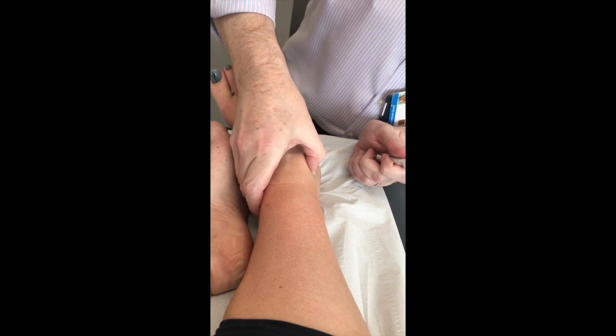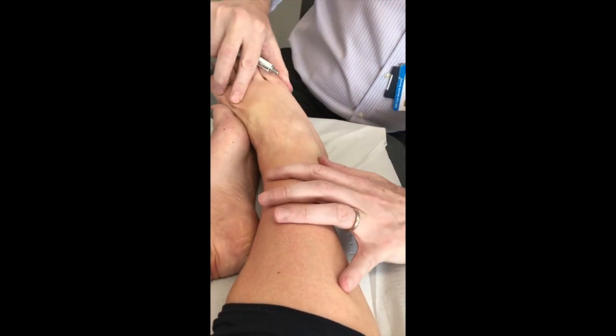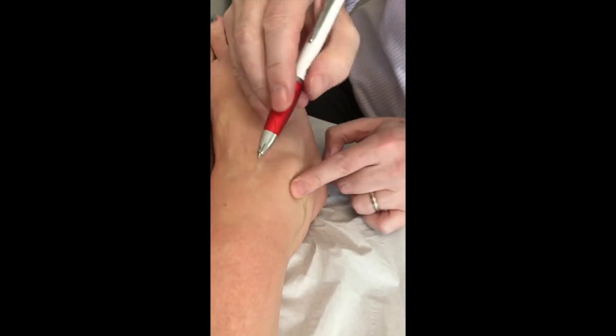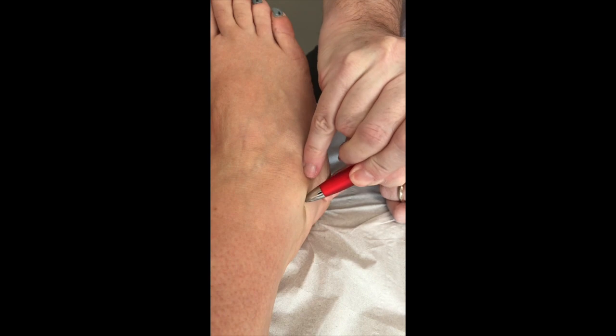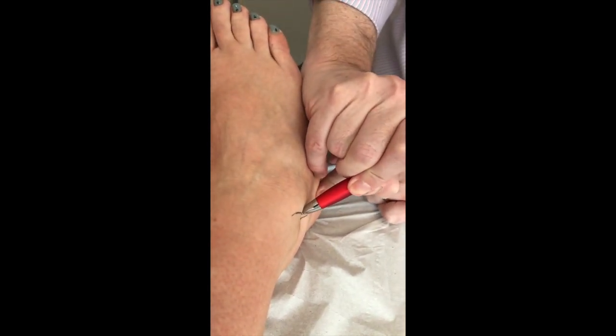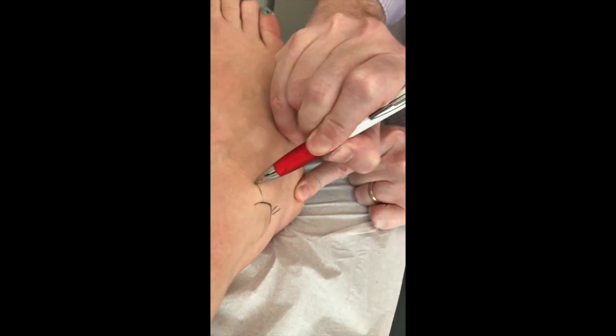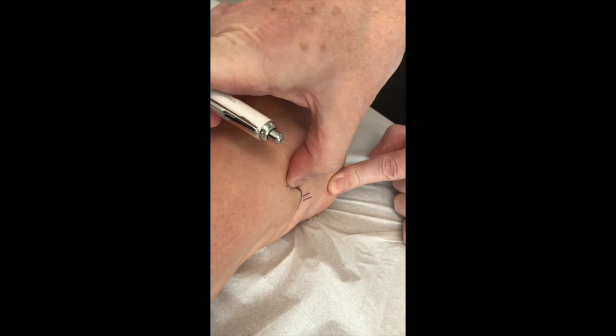So, two injections. It's your ankle that's sore a little bit, isn't it? So if I just mark up — Rebecca, if you can get that video. So this is Rebecca, not her real name — she's taking her own video. How brave is that? So I've marked up the ankle bone. Here's our calc-fib ligament, and it's her ATFL that's a little bit sore. Sore in that area there?